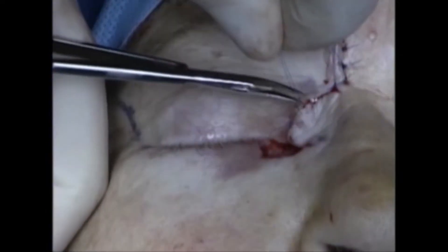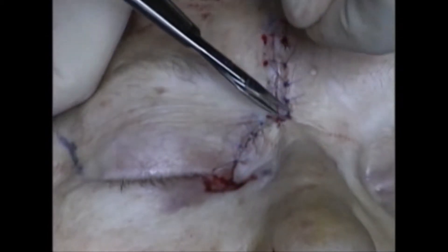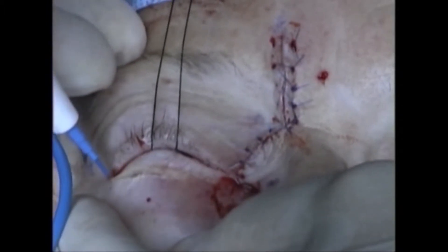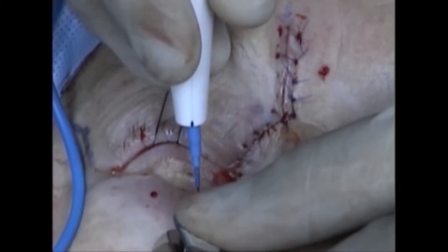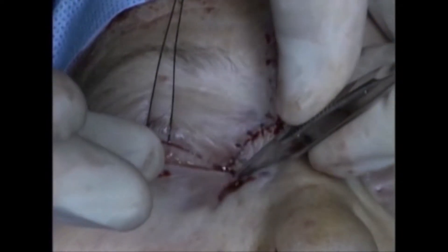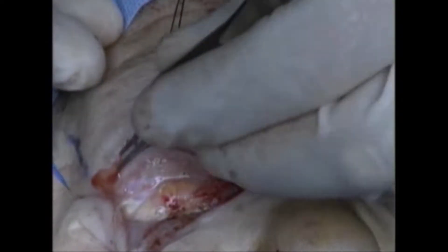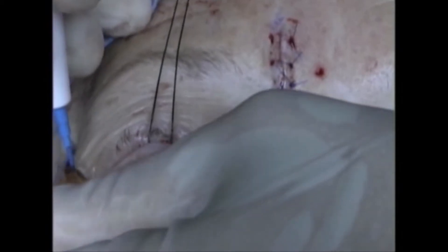The remaining portion of the flap is sutured with interrupted 6-0 Prolene sutures. A subciliary incision is then made with the monopolar cautery, extending from the defect medially to the lateral canthus laterally. Lateral to the lateral canthus, the incision is continued in a superior and lateral direction. Dissection is then carried out between the orbicularis muscle and the orbital septum. Lateral to the lateral orbital rim, dissection is carried out in a plane just beneath the subcutaneous fat.